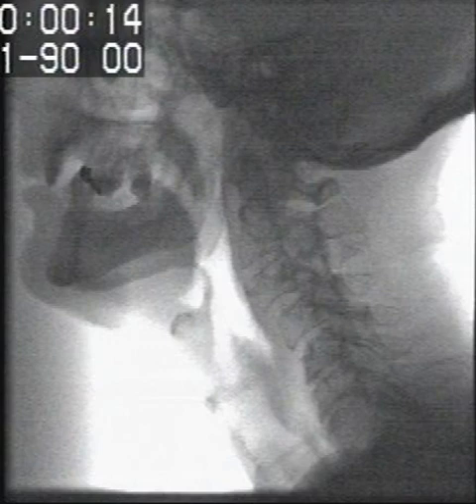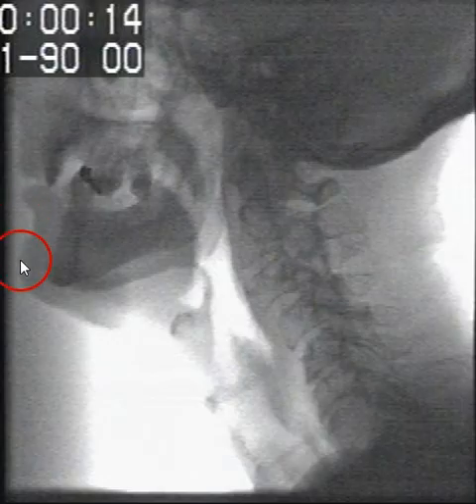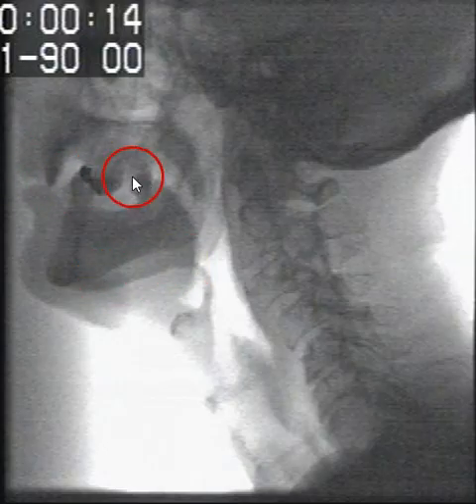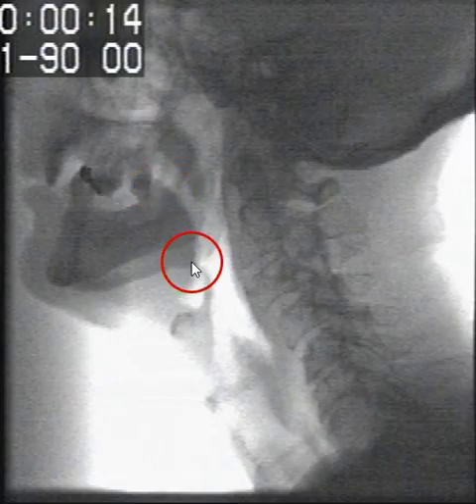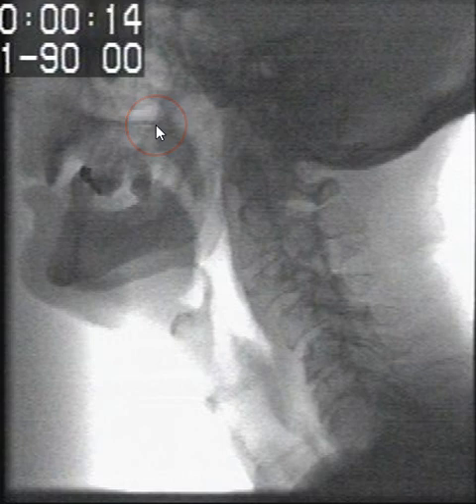In this video fluoroscopy in a lateral view, we can see the lips anteriorly. As we move down to the chin and move back, we can see the ramus of the mandible. We have the oral tongue leading down to the tongue base, the hard palate, and the velum or the soft palate.